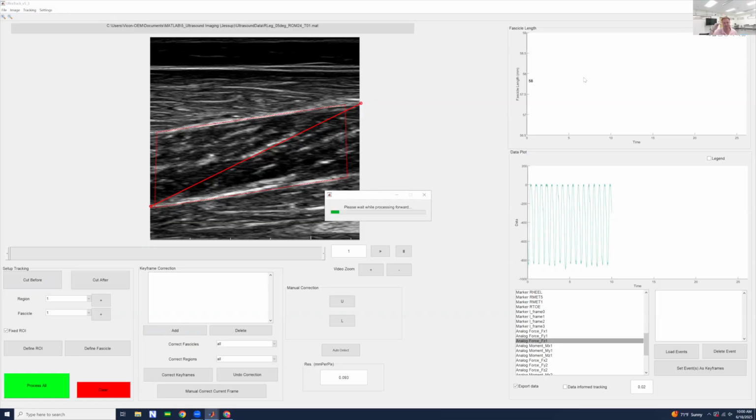We're going about 5 degrees per second. So I think dorsiflexing, holding still, then plantar flexing, going down, holding still, and then dorsiflexing again. So you should see a really controlled pattern like that with the output from this tracking here.